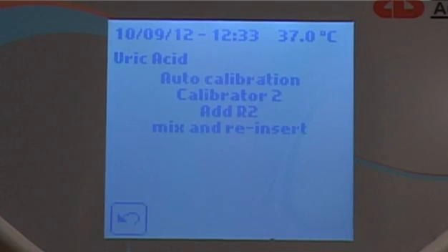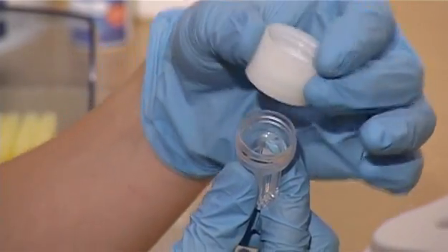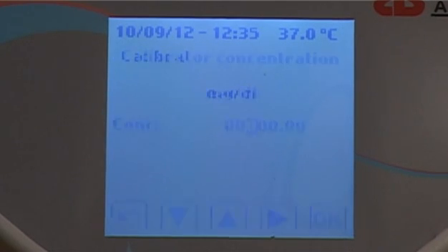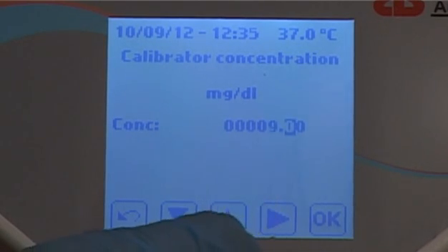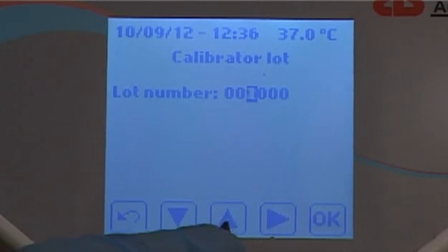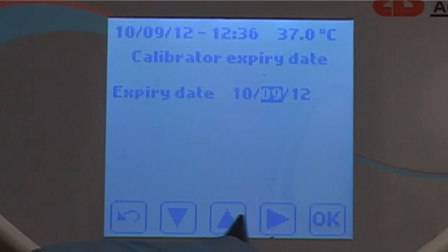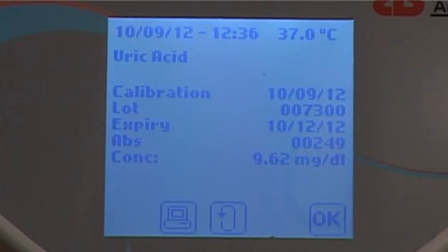To complete the calibration, add the R2 reagent and follow the instructions on the screen. When the Liquistat is finished, enter the calibration concentration — this data can be found on the insert supplied with the calibrator. Enter the calibrator lot number and the calibration expiry date. A calibration can be valid for up to 90 days or three months. Run QC material to check the calibration is valid before testing patient samples.